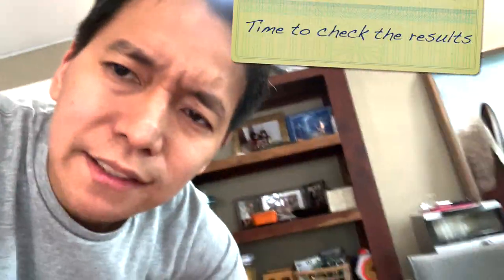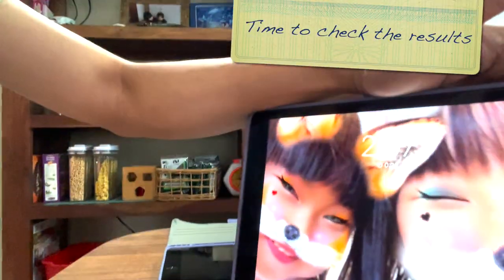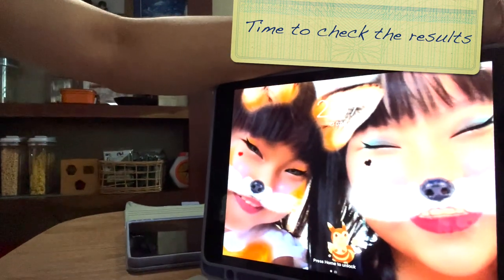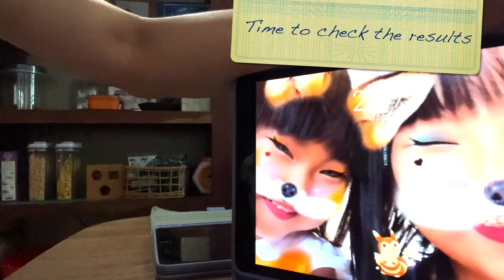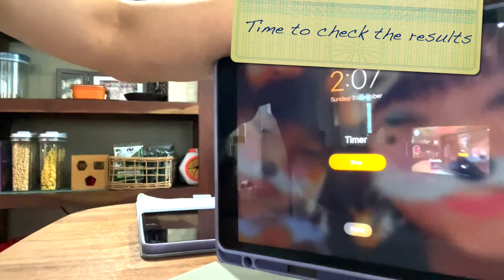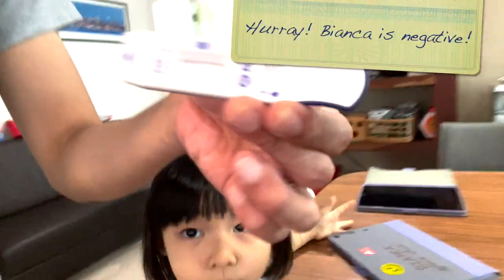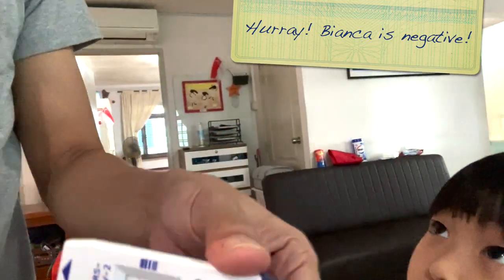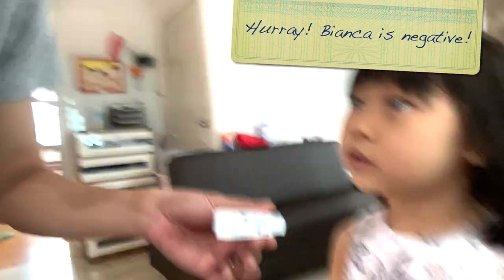I'm looking at Bianca's timer and it says 21 seconds — let's have a countdown: 18, 17, 10, 9, 8, 3, 2, and 1. The timer has rung — it's time to check. Bianca's one is the one near the Christmas tree. Megan is going to take Bianca's one and see. She's negative! Hooray! I was smiling with tears in my eyes. Bianca, you're negative, which means you don't have COVID. Are you happy?